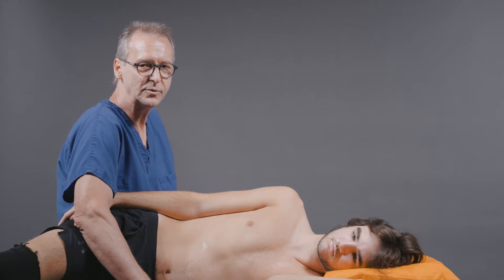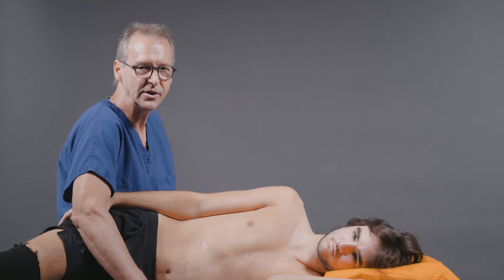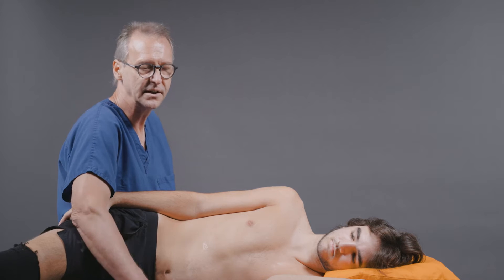It is very similar to the RUSH exam. However, I really think of the RUSH exam as something you do with somebody who's in a critical situation. This is the type of examination that emergency physicians and critical care physicians can do, but also the family practitioner or the interns working in the outpatient setting in their clinics.